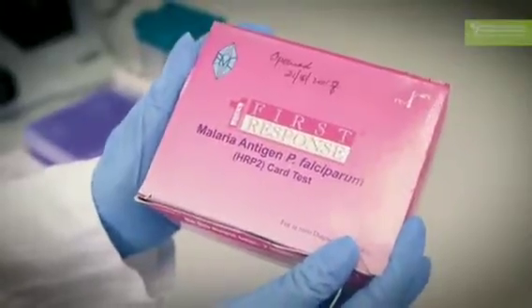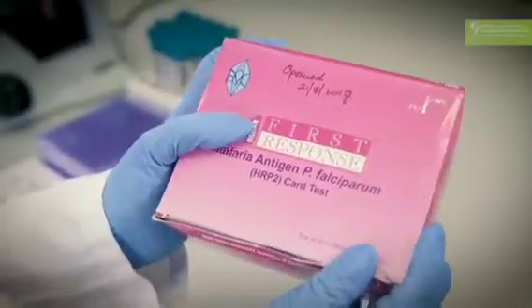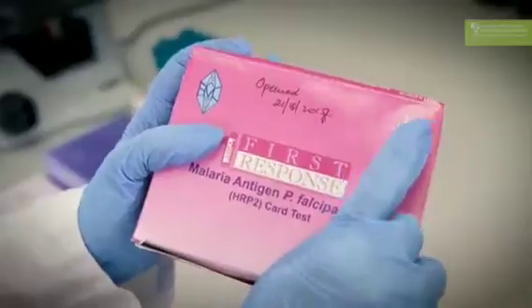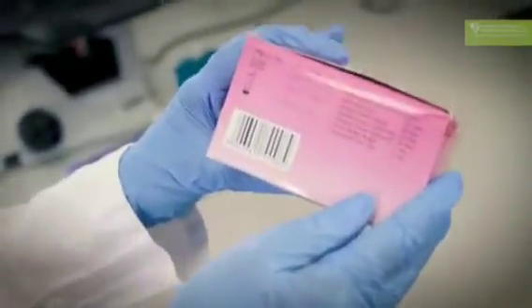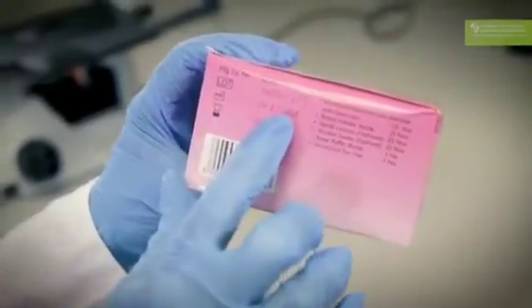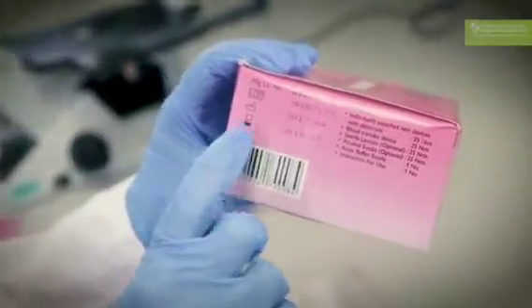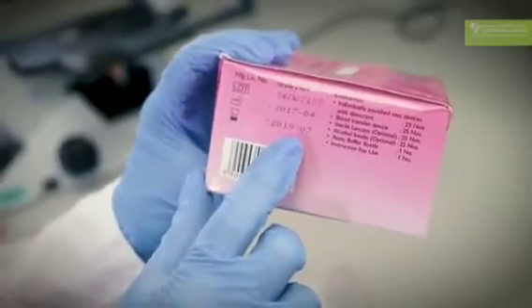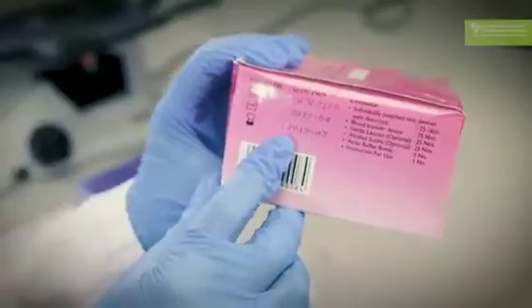When you get a First Response rapid diagnostic test box, you need to ensure that you check two things. What the temperature range is, so this test can be used from 1 degree to 40 degrees, and the most important thing you need to check is the expiry date, and this is on the side of the box. And here you have the date that it was manufactured, so it was manufactured in April in 2017, and then the most important thing is the expiry date, and this only expires in March 2019, so these tests are still valid and therefore you can use them.